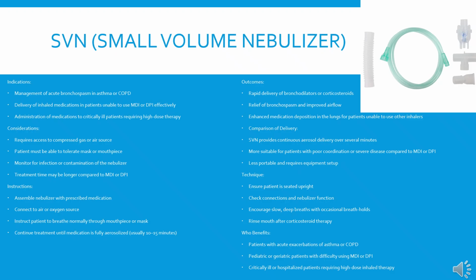The instructions: assemble nebulizer with prescribed medication, connect to air or oxygen source, instruct patient to breathe normally through mouthpiece or mask, continue treatment until medication is fully aerosolized, usually 10 to 15 minutes. Outcomes: rapid delivery of bronchodilators or corticosteroids, so rapid improvement.